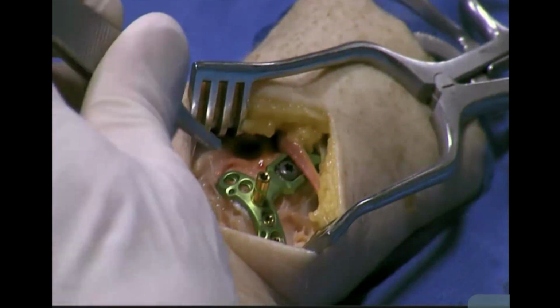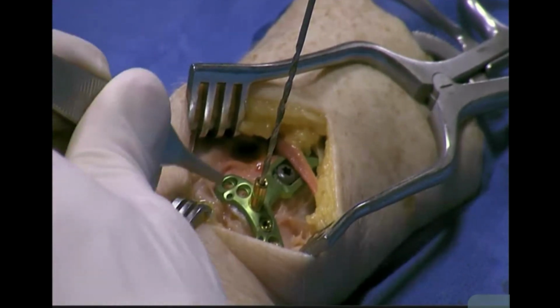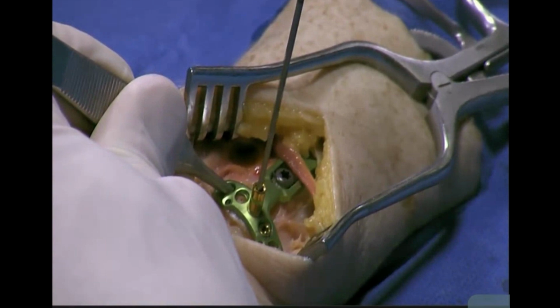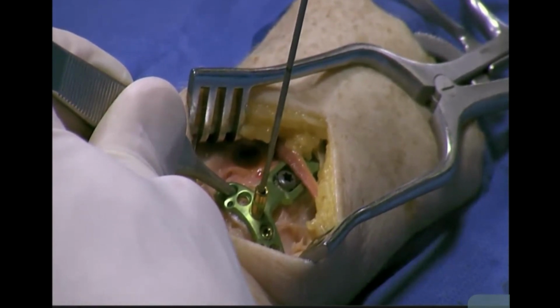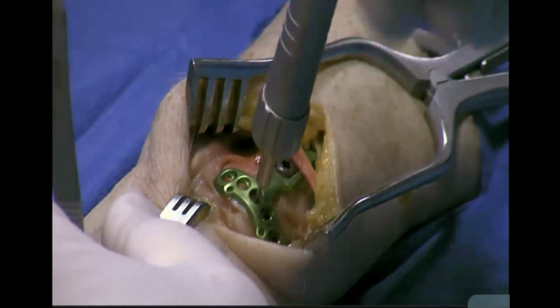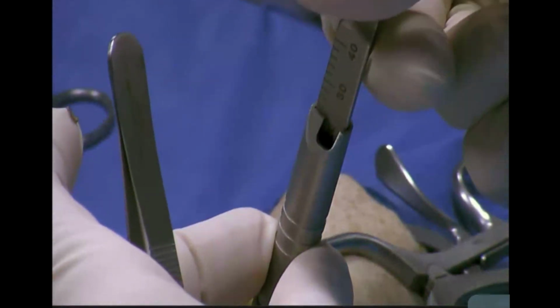Here we're going centrally. Frequently in intra-articular fractures, this central screw between the scaphoid and the lunate facets is not as useful as frequently in the area of comminution. So I can feel bone all the way down onto the volar cortex and 24.